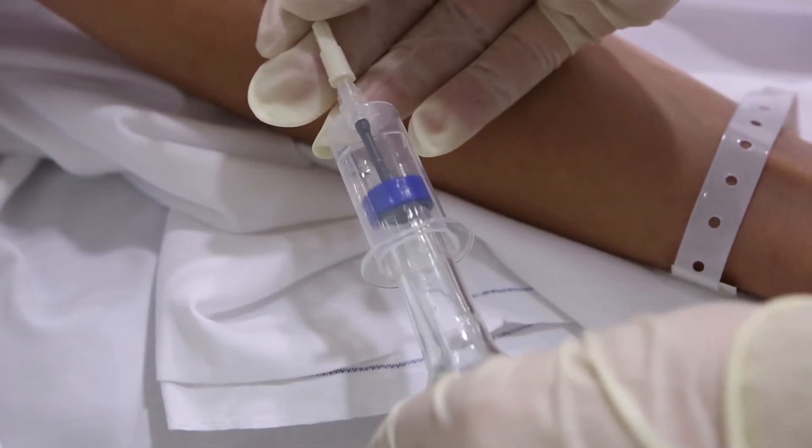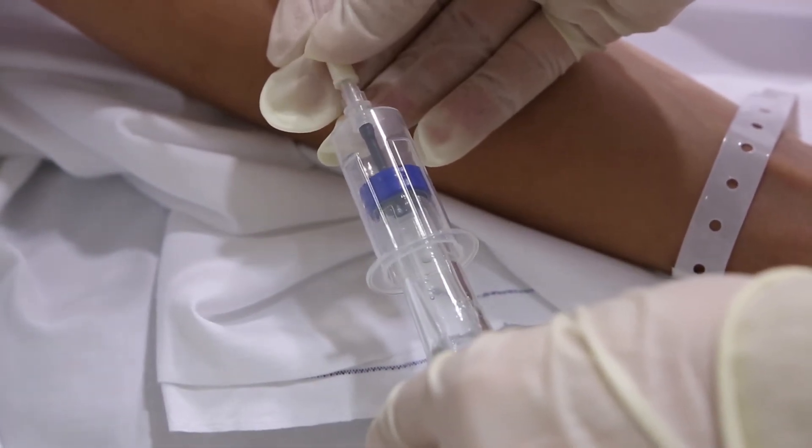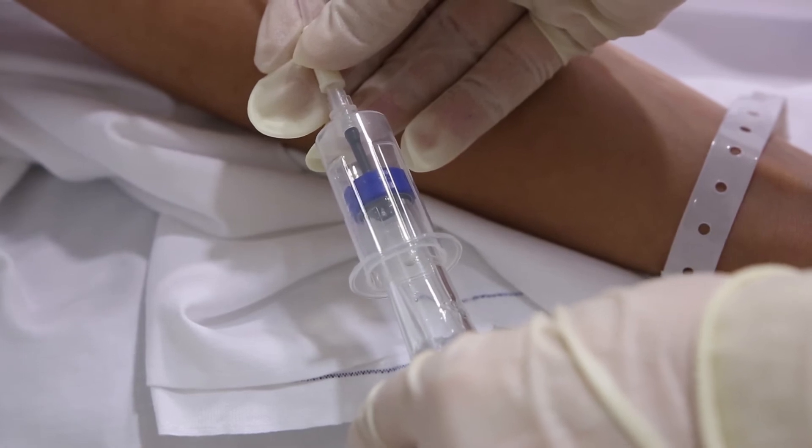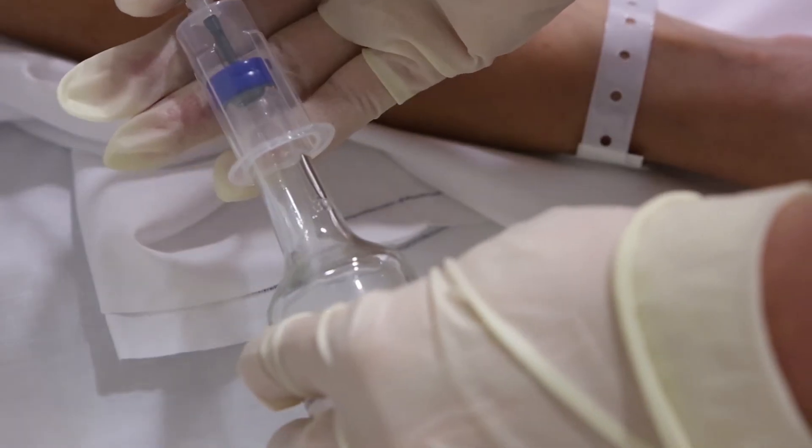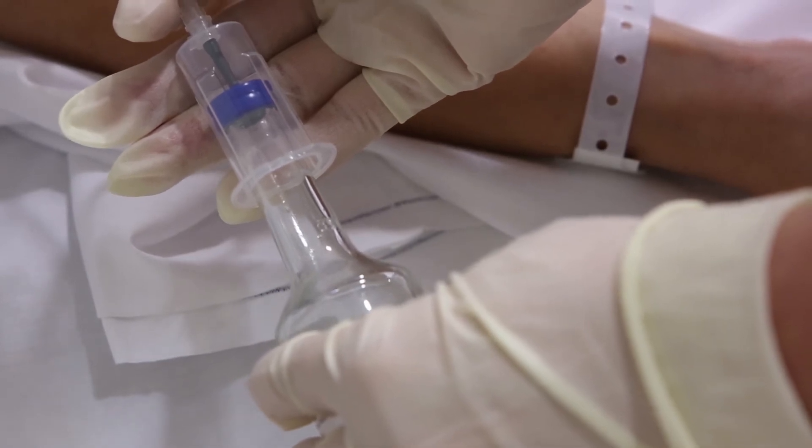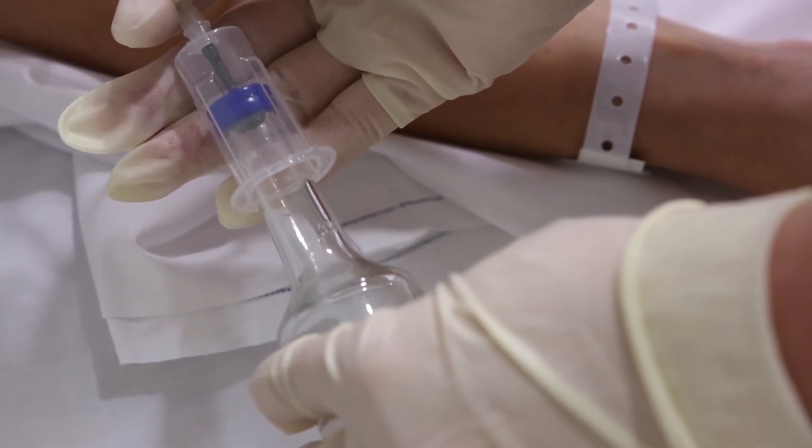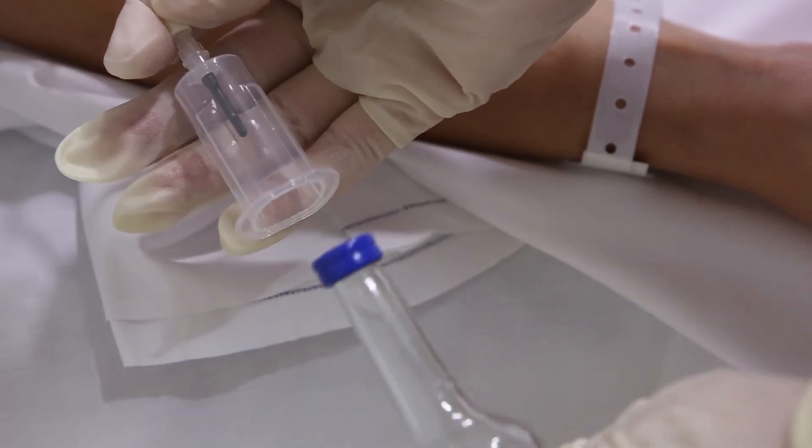Next, fill the blood culture bottles by inoculating the aerobic bottle first as most pathogenic organisms grow in aerobic conditions. Position the blood culture bottle as shown to ensure that the liquid contents do not reflux back into the patient which may lead to anaphylaxis.